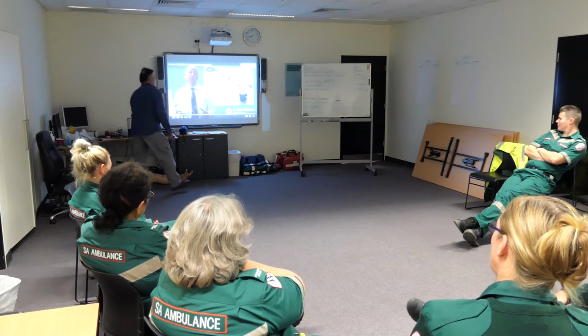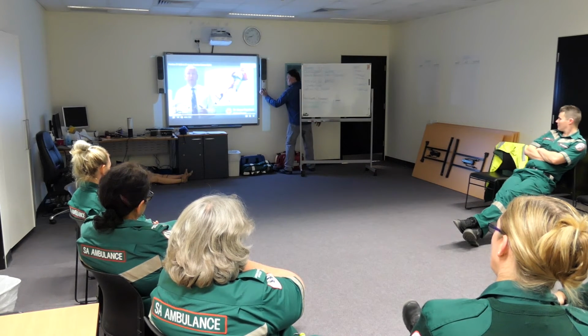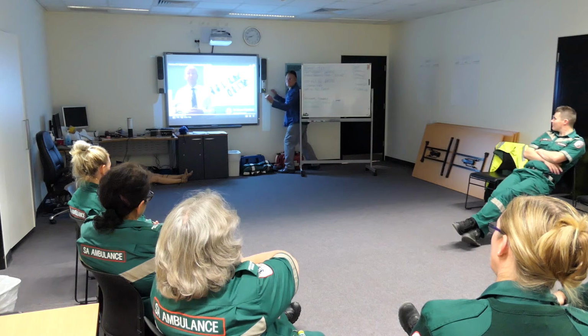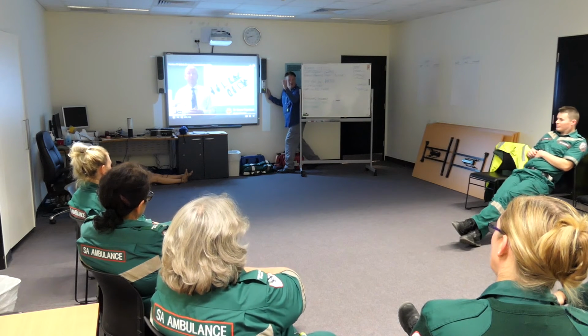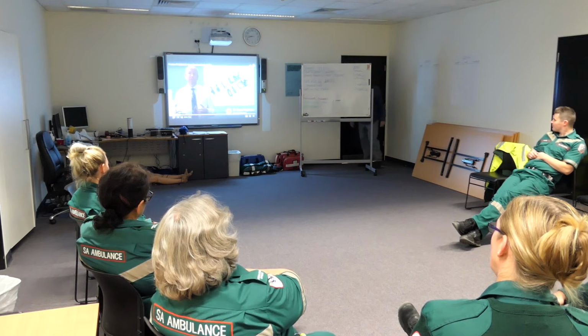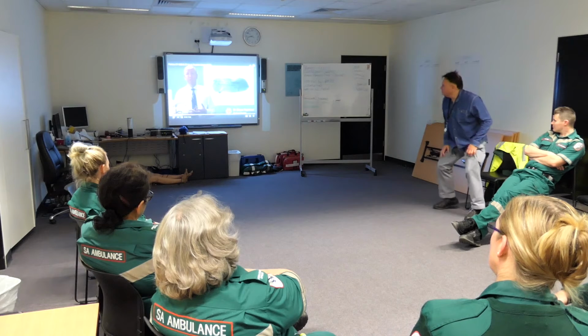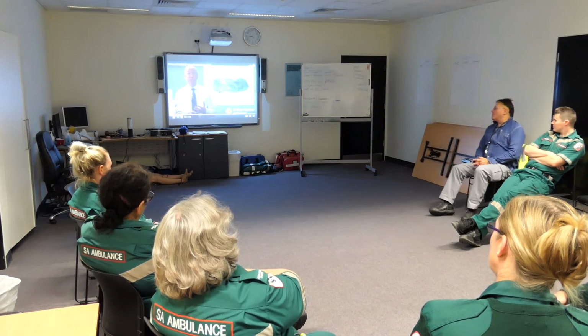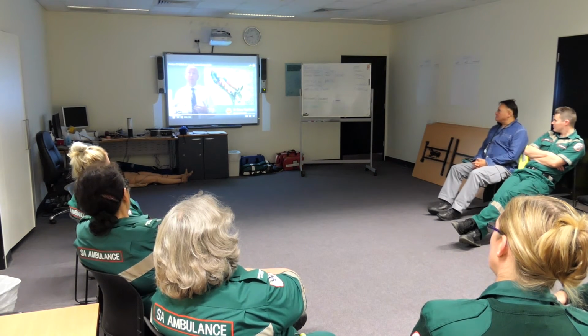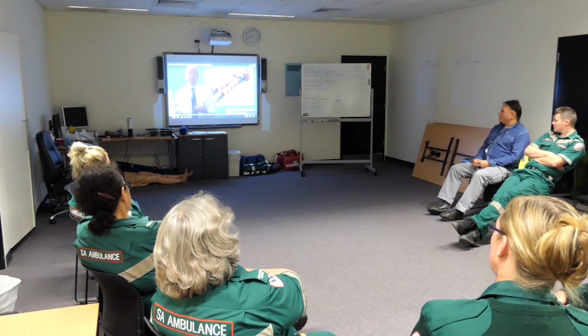The CT6 traction splint is a significant investment by the QAS in patient care. The Donway has been a long doyen of the service and has done really well for the last 10 years or so. But as technology has improved, it's important that the QAS moves with that technology. The CT6 offers the following advantages. It's light, it's small, it's easy to use, it can be used on paediatric patients. It can be used for patients with bilateral femoral fractures, which we haven't been able to do with the Donways previously. And most importantly, it can also be applied to patients who have a pelvic splint in situ.